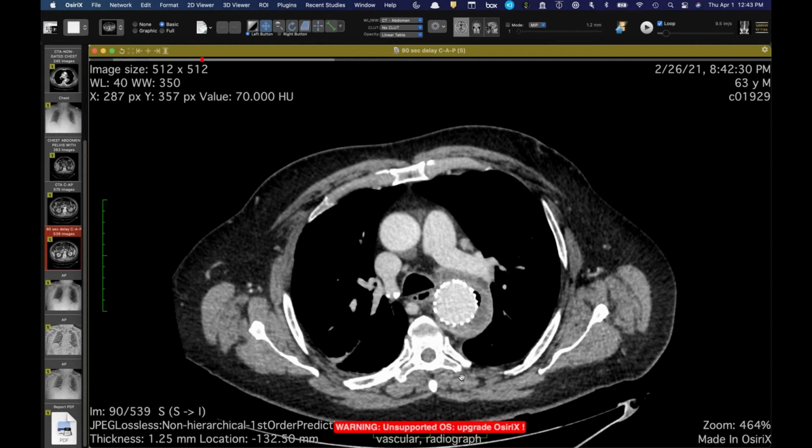There was a good article in AJR, I think about a year ago, looking at the accuracy of CT esophagram for leak. And it turns out it's pretty good. We've been trying to do it lately, and it helps if you get multiple phases. If you do a non-con and then a prone and supine swallow, it's very, very accurate when you do all three phases. What do you use?